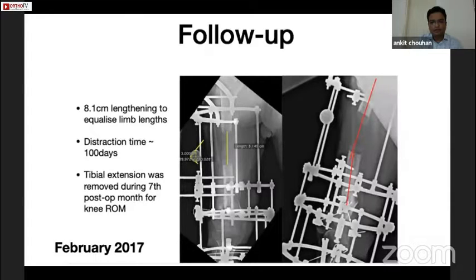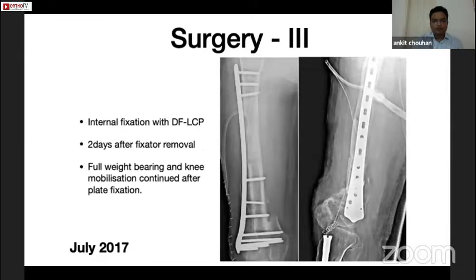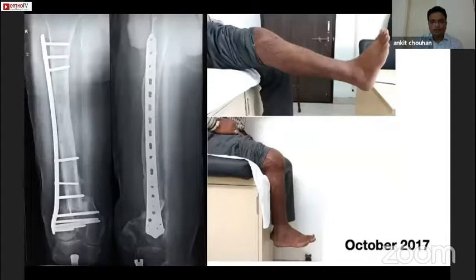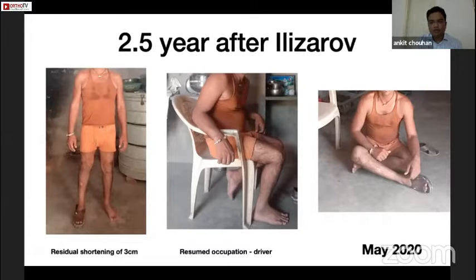Over 100 days of distraction, around 8 centimeters of lengthening was done. In the seventh month, the transtibial frame was removed and knee mobilization was started. The fixator was removed in the tenth month with no instability and the patient was able to walk full weight bearing. After a couple of months, the fracture site and regenerate region was spanned with an internal fixation plate to allow immediate weight bearing and continue knee mobilization. Three months after plate fixation, the fracture had consolidated with a reasonably good range of motion at the knee. Two and a half years after release, the patient is still short by three centimeters and uses a shoe raise but has resumed previous occupational activities, can sit on the floor, and drive long distances.